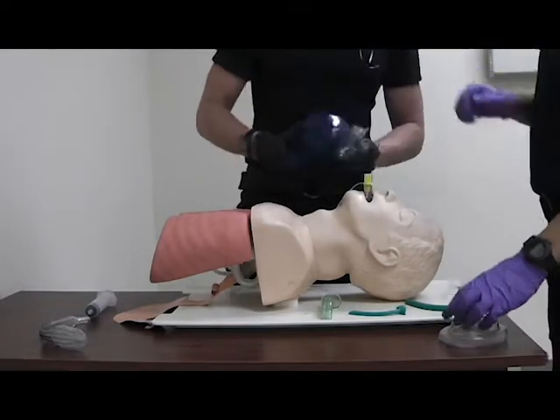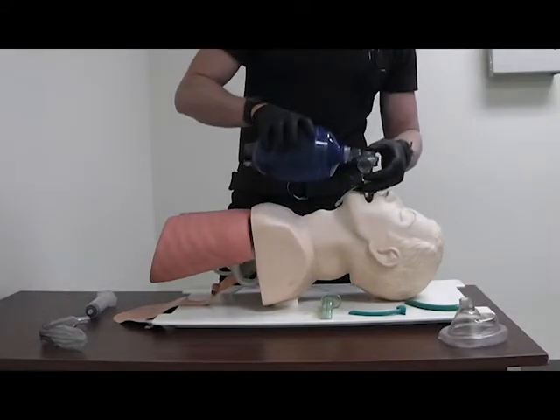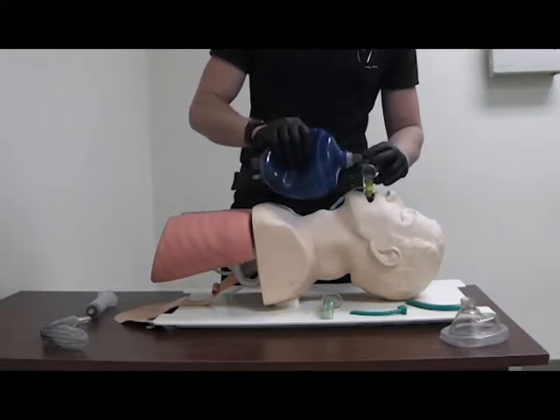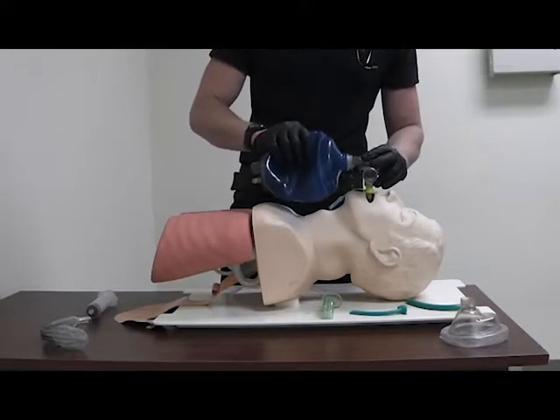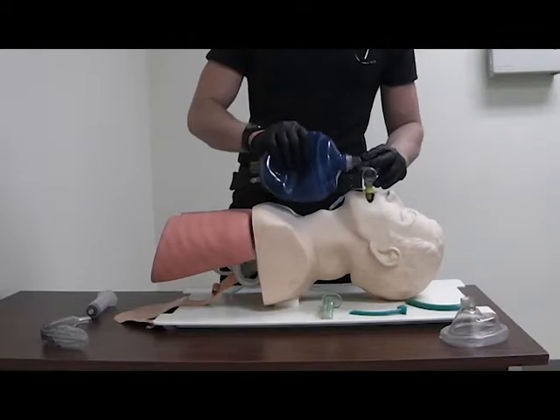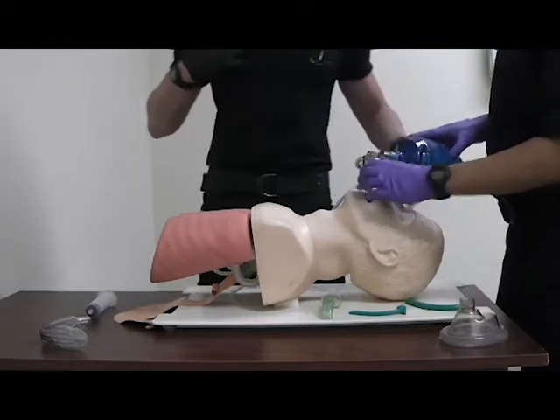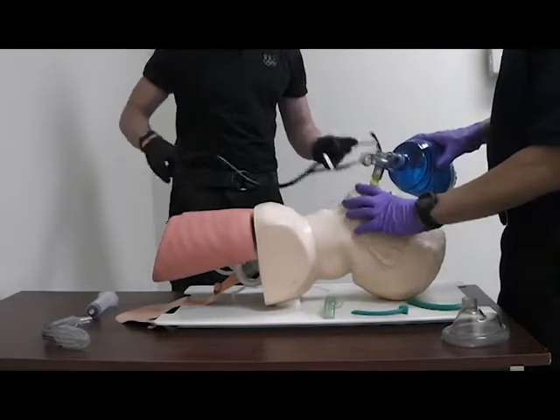Remove the mask from the bag and resume bagging at a rate of 12-20 BPM. While your partner resumes bagging, check airway placement.